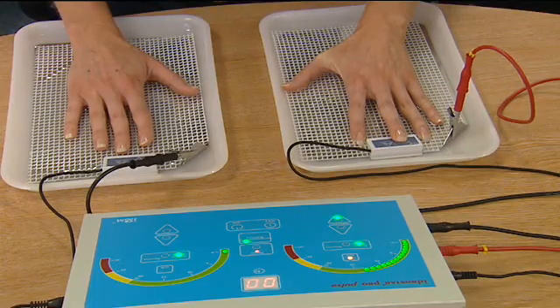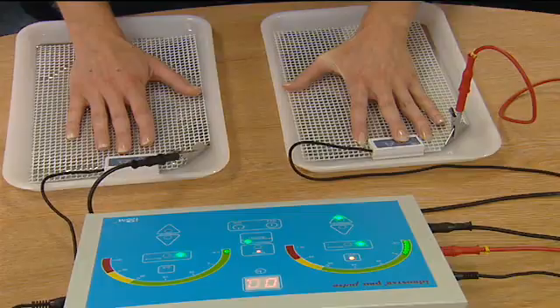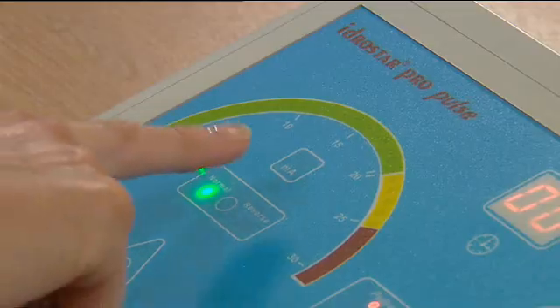After 10 minutes, turn the power down by depressing the downward arrow on the remote control until there is no visible current. Change the polarity by depressing the normal reverse button.